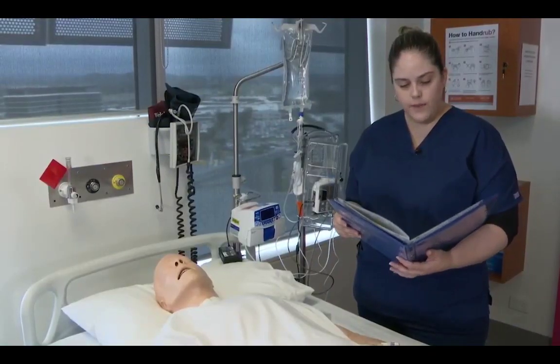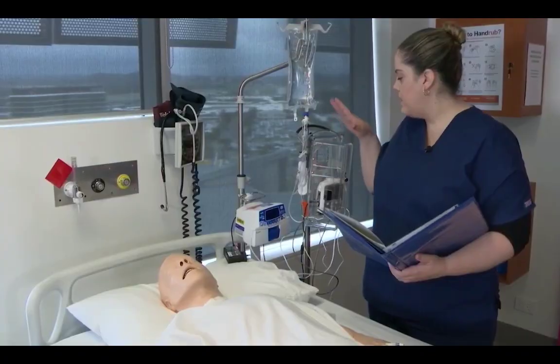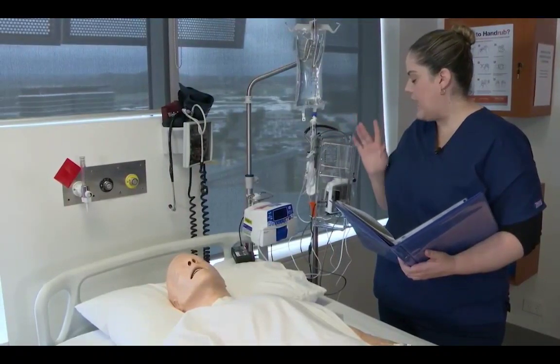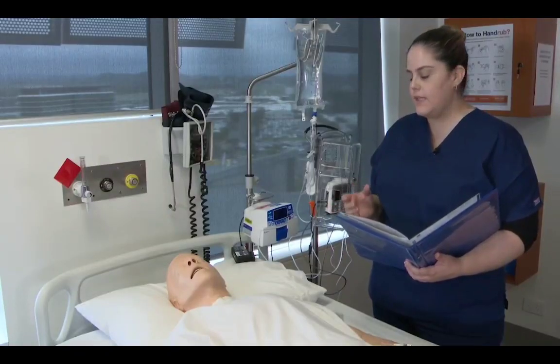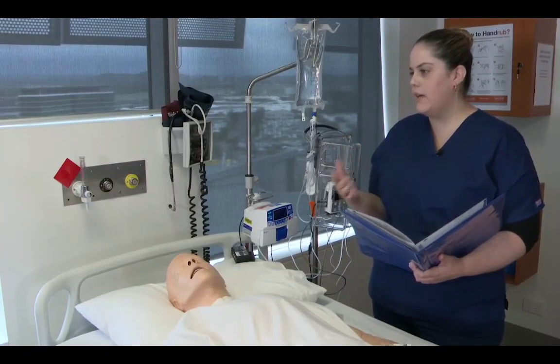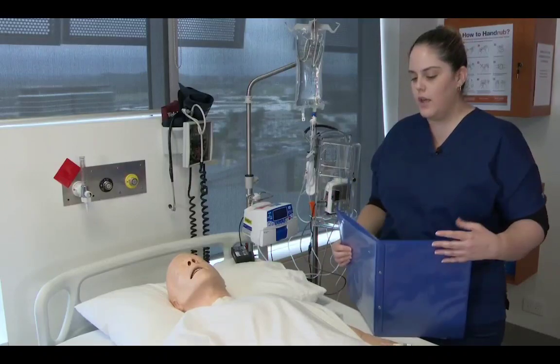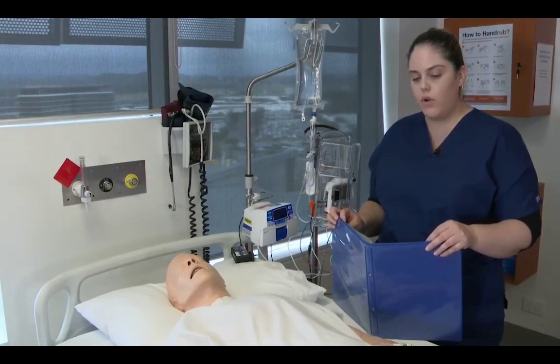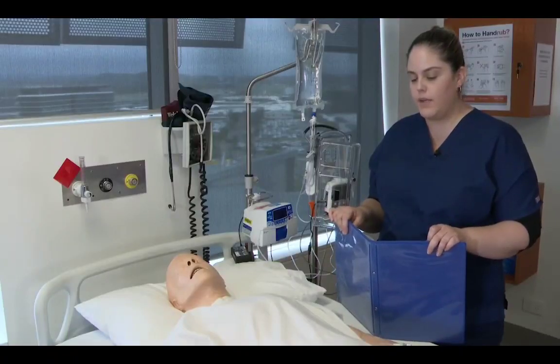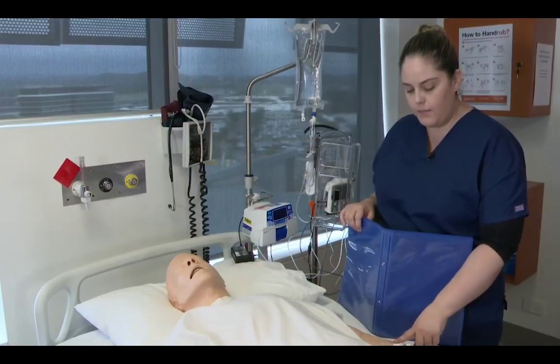So John, just to give you a bit of information about what we're doing here. So I've set this up. This is a PCA. It's also known as patient-controlled analgesia. And the idea of this is that there's a medication in here, it's an S8 medication known as fentanyl. And so fentanyl is a really strong pain medication that we can give via the cannula in your arm here.